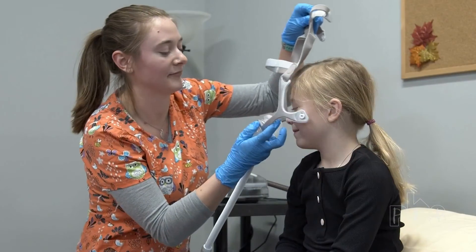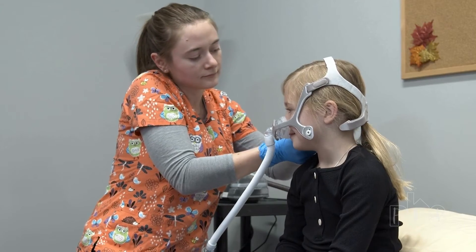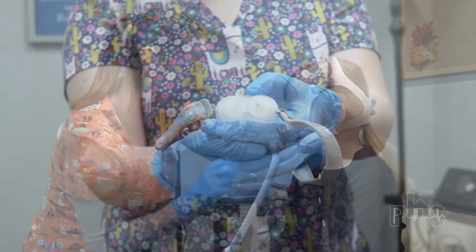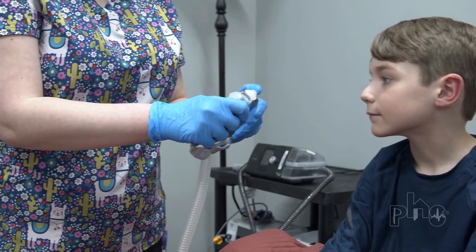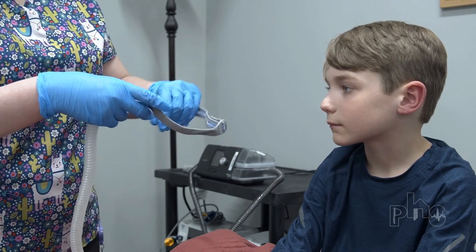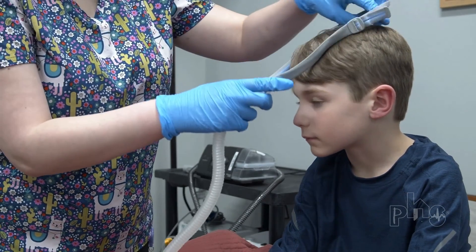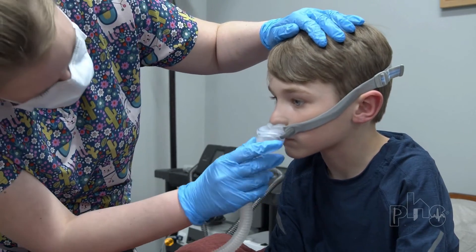Nasal masks fit over the nose and are a good choice for a patient who sleeps with their mouth closed. Nasal pillow masks fit into the nostrils. These masks are popular with patients who find the nasal mask uncomfortable. They can also be used if the patient develops pressure sores or skin breakdown from other masks.